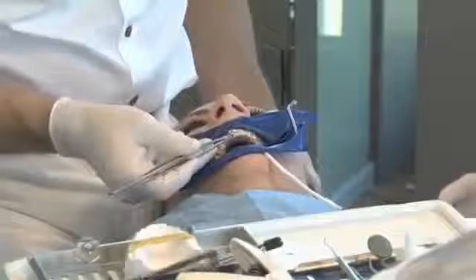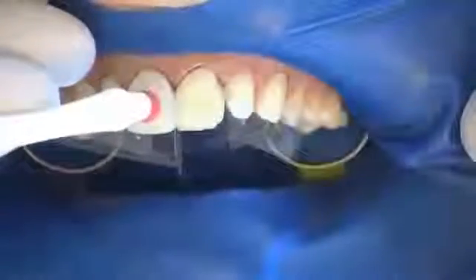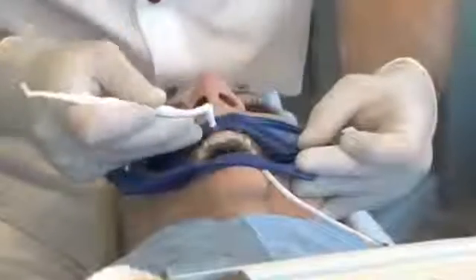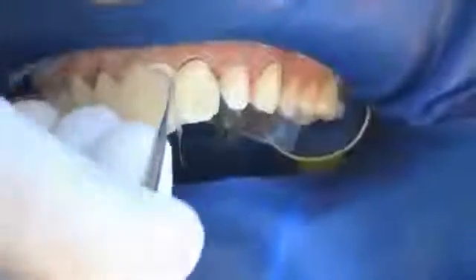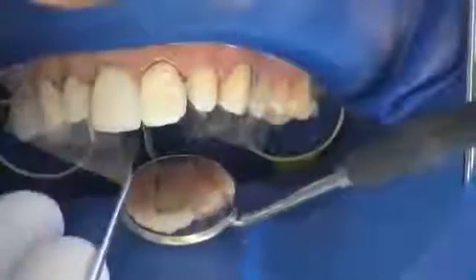The first COMPONEER is placed on the tooth using a pair of tweezers. The placer with its silicone attachment enables an even pressure to be applied, which does not vary in direction. The excesses are removed by cutting with the spatula specially designed for the purpose, and the composite is adapted exactly to the marginal areas.